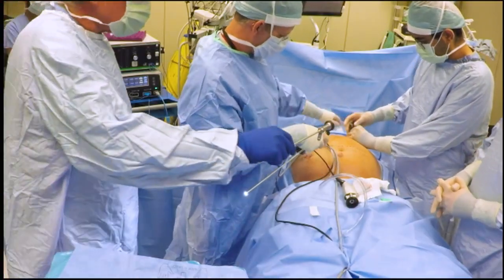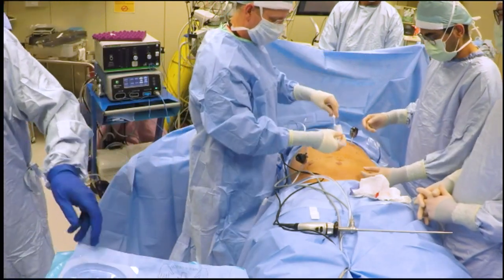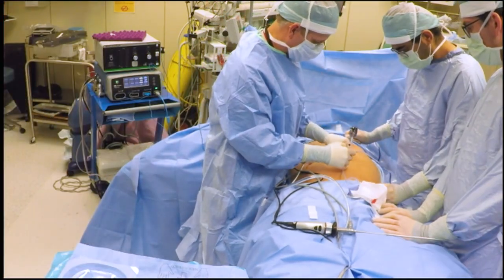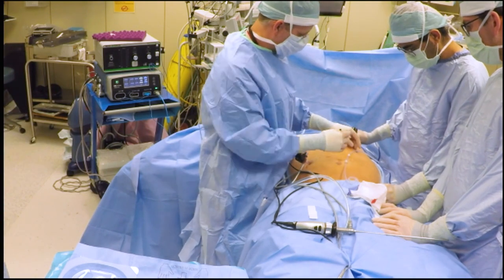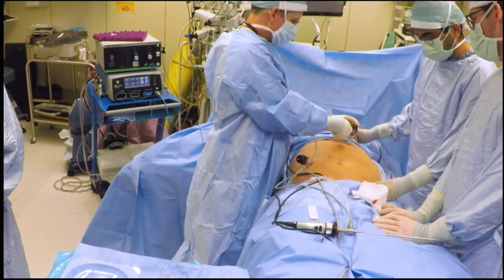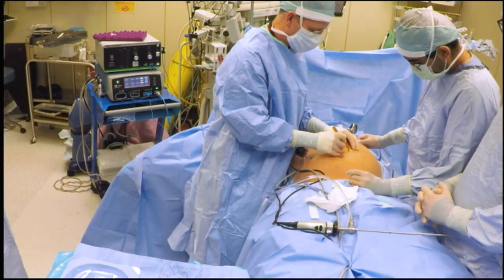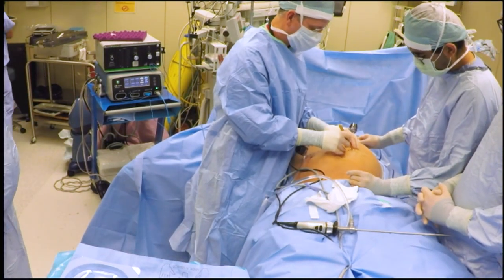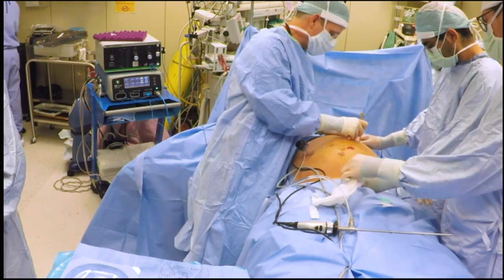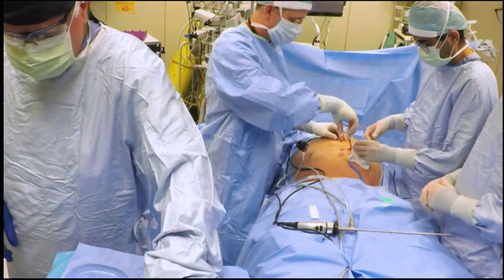With the abdomen desufflated, we determine our catheter position by placing the coils at the level of the pubic symphysis and then mark our catheter entry and exit sites. Then we re-insufflate the abdomen, and in the peri-umbilical region, we make a 2 cm paramedian incision, which is where the deep cuff will sit. The exit site incision in the left upper quadrant should be about 1 inch away from the superficial cuff.